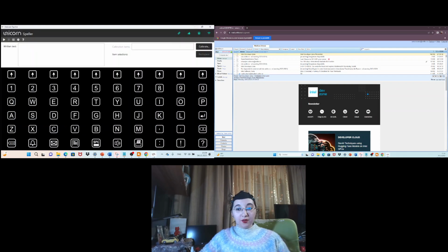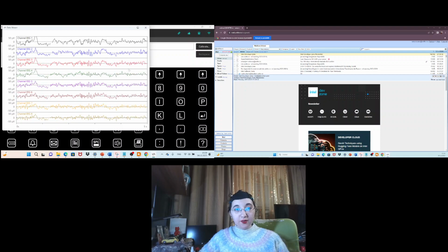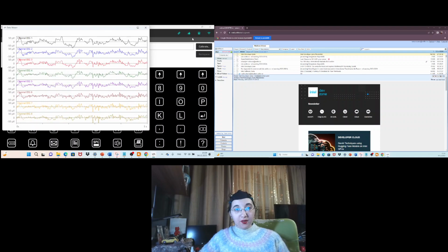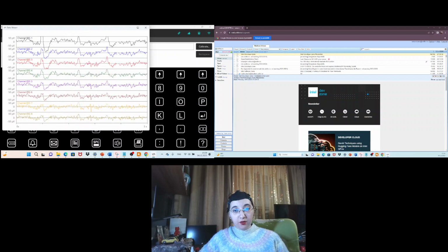Okay, so here is the Unicorn P300 speller board offered by the g.tec company, and here is the data viewer with the current acquisition or detection of the raw EEG signals. And here in the right corner, you can see the OK indicator that shows the excellent quality of the acquired EEG signals. I blink, so here you can see the pattern of the EEG blinking. So everything looks perfect.